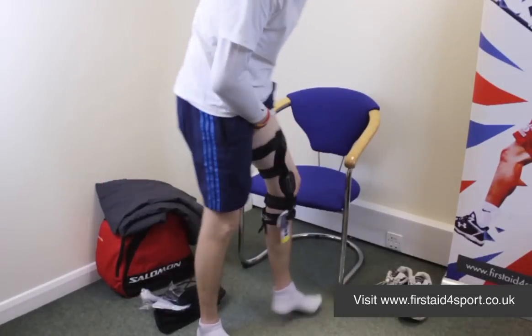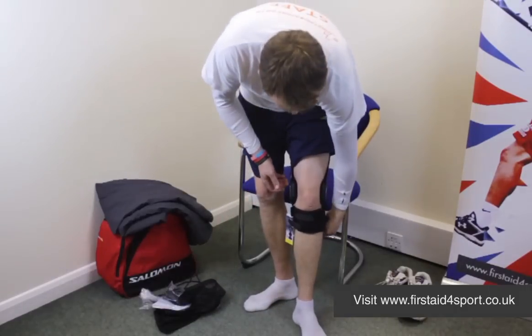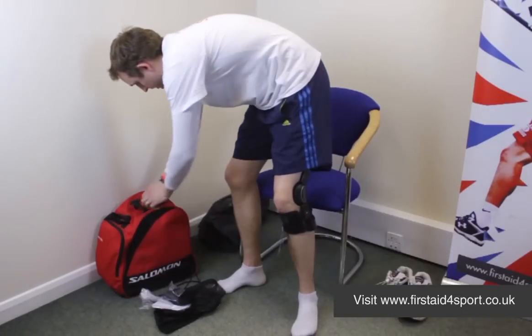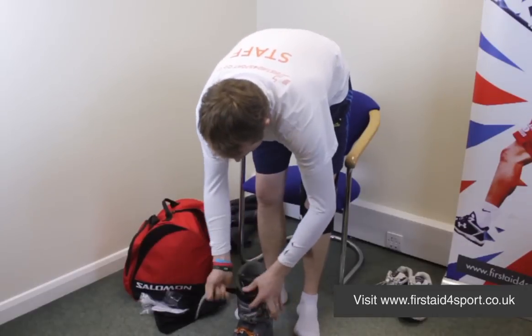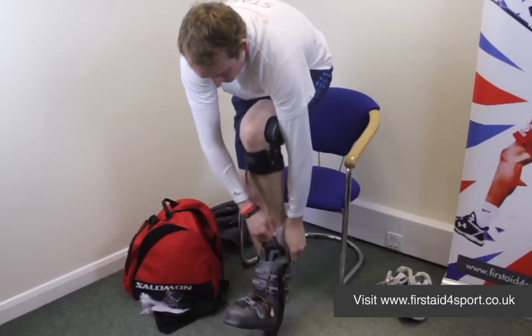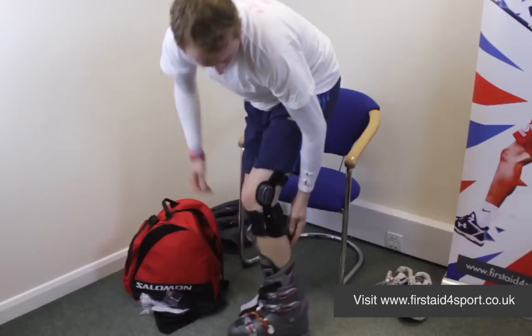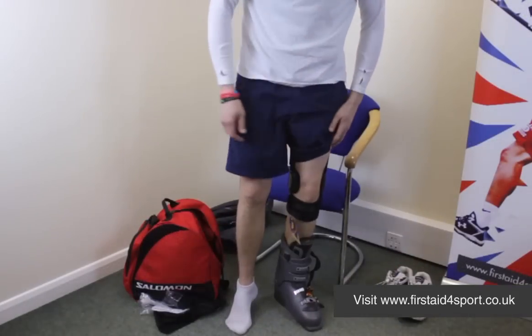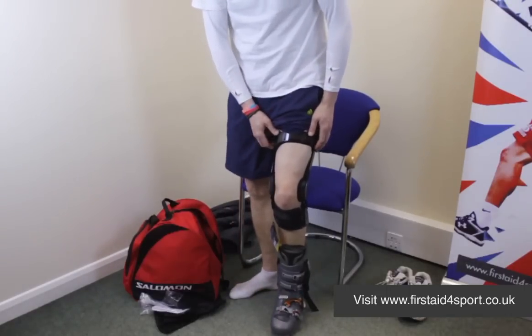When you get up, you can feel if it's right for you. You can see that it's a very short calf. I'll prove how short it is because I've actually got my ski boots with me. You can slide your foot into your ski boot and you've still got loads of clearance off the back. It's super low profile, so you can enjoy your day skiing, no problems. This is the Donjoy Full Force ACL Knee Brace.